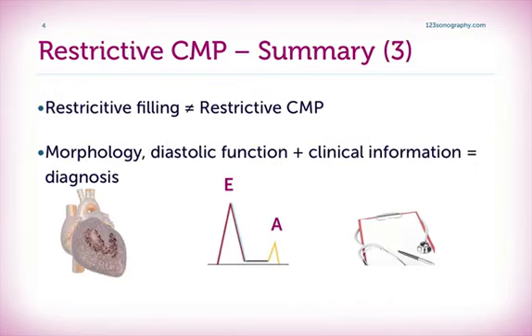Remember, don't confuse restrictive filling with restrictive cardiomyopathy. Usually, it is a combination of the morphology in the echo, the presence of diastolic dysfunction, and typical clinical information which leads to the diagnosis.